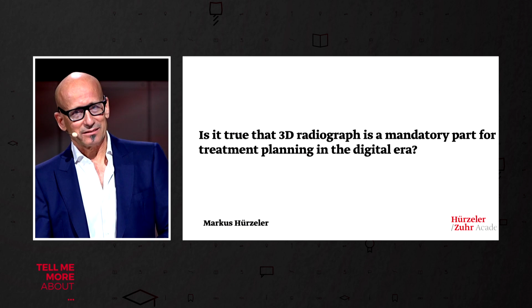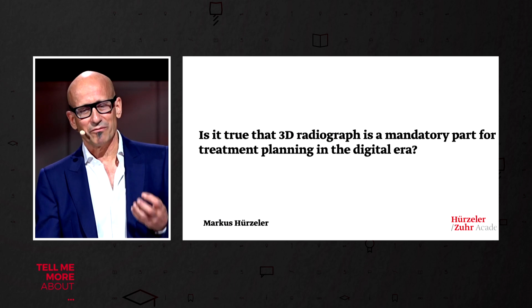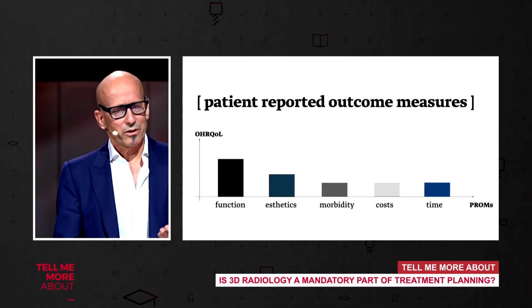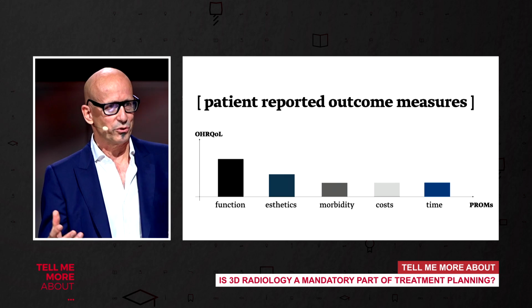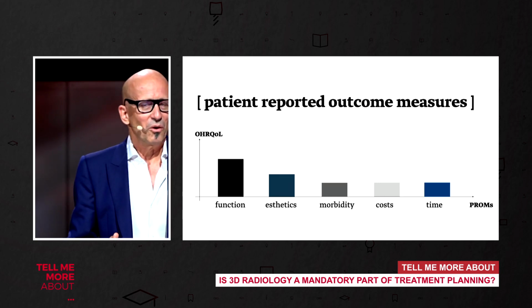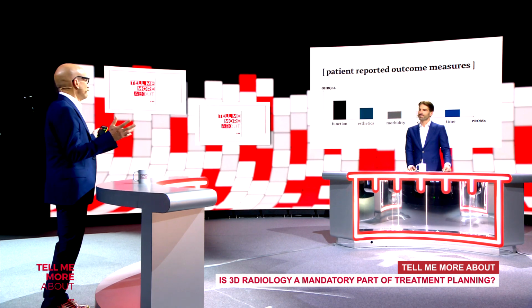But what I can say with my own experience, I think it becomes more and more a very important tool of implant therapy today. And let me now share with you a little bit our thoughts, and especially it's more the patient. When we look at the patient, they have today clearly wishes and expectations of the implant therapy we are going to do. It's not anymore a discussion, does an implant integrate into the bone? Or does it look more or less okay? It's about what does the patient really want from us?